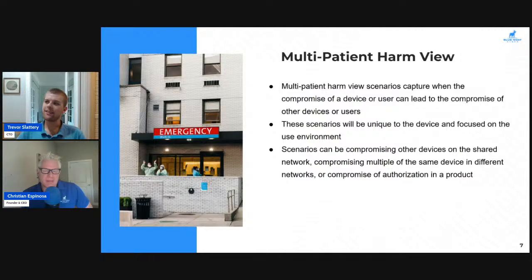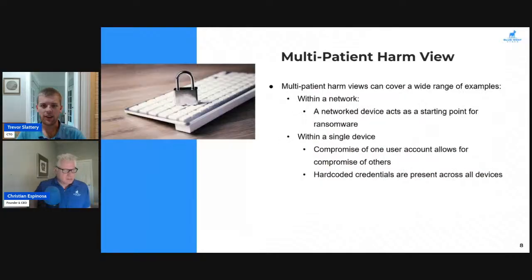That is a little bit of a difficult situation to cover. Oftentimes, it just requires expertise in the security space, understanding how similar vulnerabilities have worked in the past. But there can be some characteristics of specific attacks. I'll jump over to the next slide here where we have some of these examples. And I'll actually start at the bottom and we can work our way back up. So hard-coded credentials, for an example.